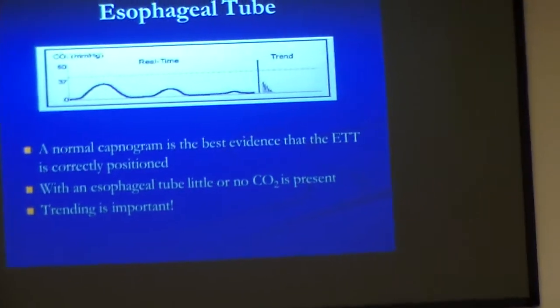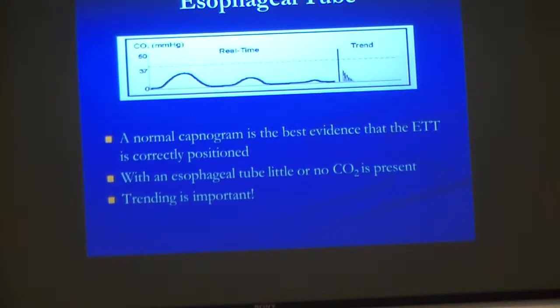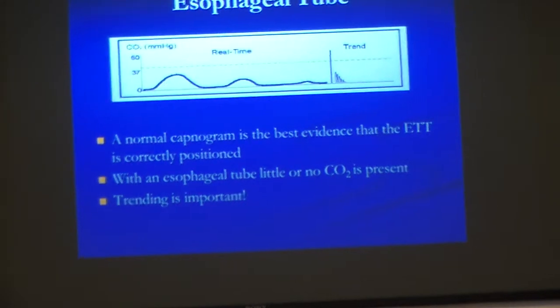It records every time you push something, but if you don't push record, it won't record anything. If you snapshotted a bunch, is it going to give you a trend? I've never seen it produce a trend. I'd have to look. I don't know if it does or not. Good question. But I know the only stuff that gets stored within the monitor is by pushing the snapshot, not by pushing the record button.